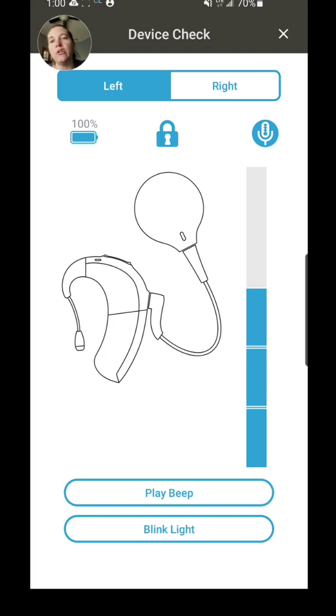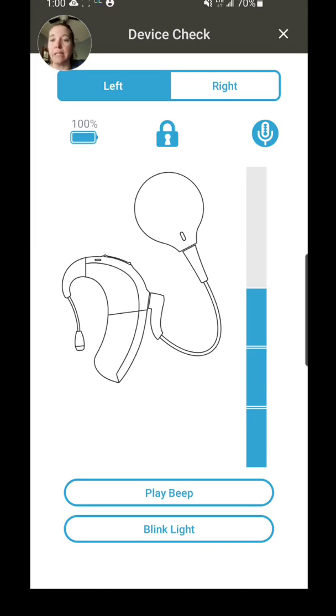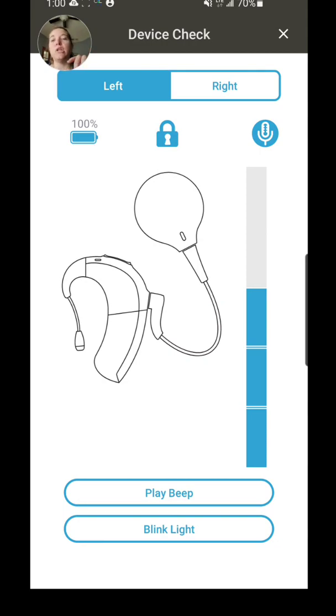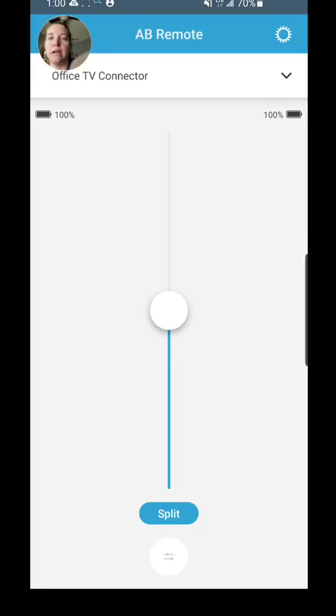Now if you are a newly activated patient and your audiologist has set you up with progressive levels, this is where you will be able to see those progressive levels. I don't have progressive levels so I can't show them here, but that will appear right below the Blink Light button and it will say Progressive Level, and it will tell you which progressive level you are on and you will also have the ability to go up or down on your progressive levels there.